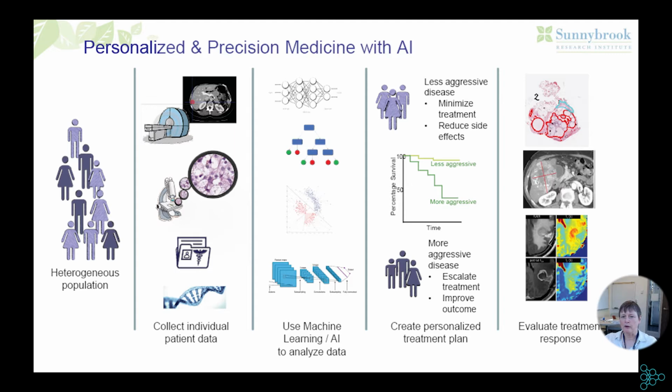This is very similar to Shazia Akbar's talk earlier on lung cancer. So we're trying to do the same sort of thing but using digital pathology in this talk here. And then also what we need to do after we've given the therapies, we want to evaluate treatment response. So we want to be able to take the images after treatment and decide, did the treatment work?